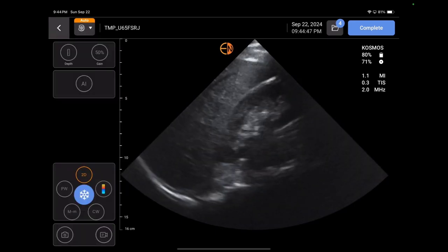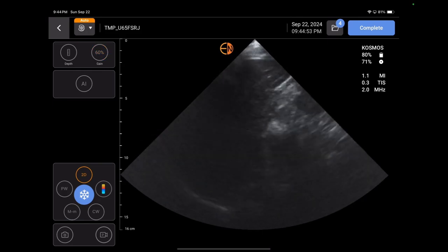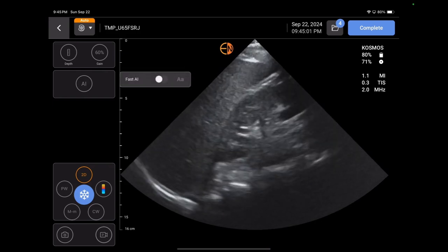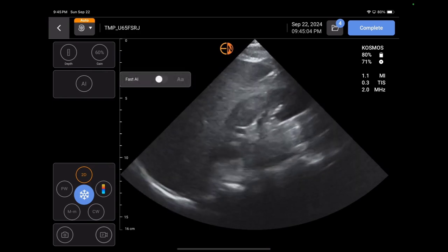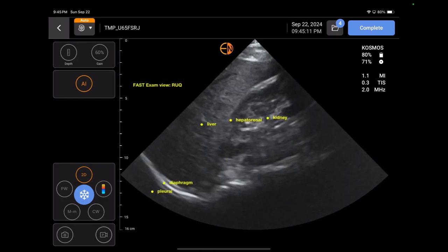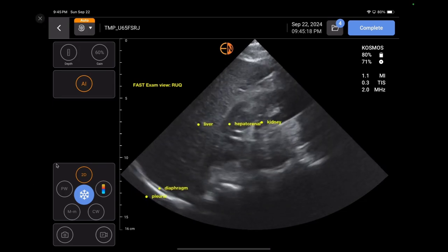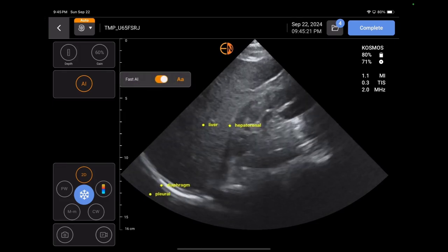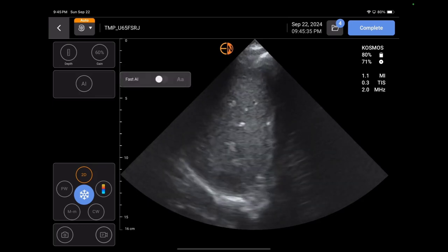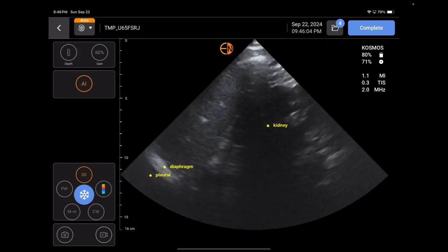Here we have the abdominal scanning. Here's a right upper quadrant on myself. The gain can change as needed — I need a little bit more gain. If you're doing a FAST exam, it's really easy to do. It gets in between the ribs and you can see the nice quality of scanning. It has an AI feature — if we turn on the FAST AI, it will actually label it for us. If you're a beginner and want to know what you're looking at, you'll see all the labeling. It tells you you're in a right upper quadrant view. In my left upper quadrant view, if I turn on that AI, it tells me what's what — you can see the splenorenal come in and out as the labeling appears.